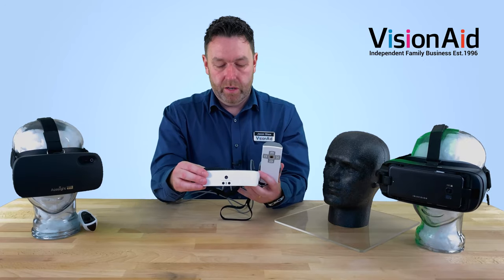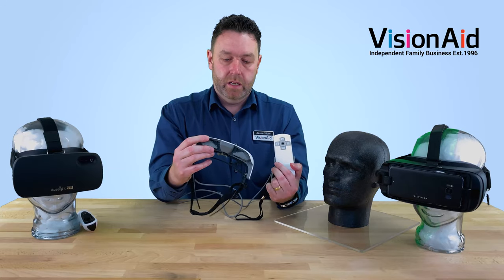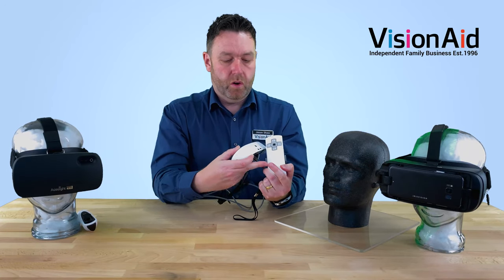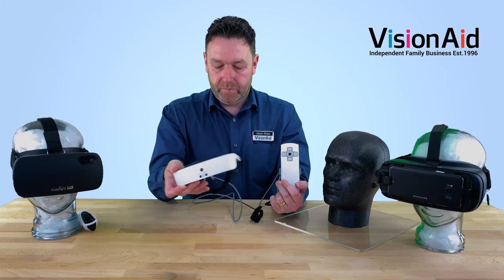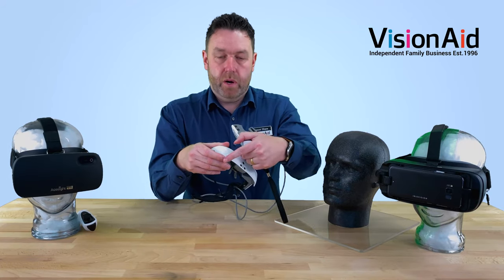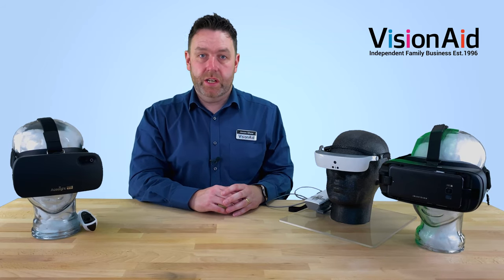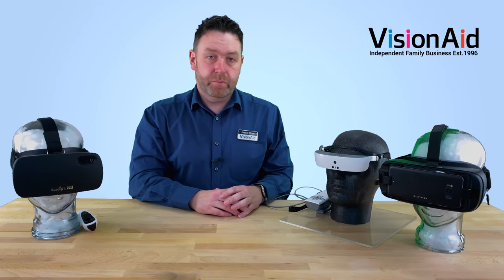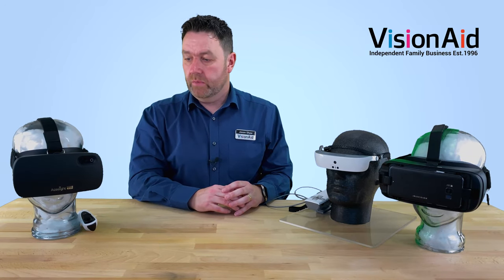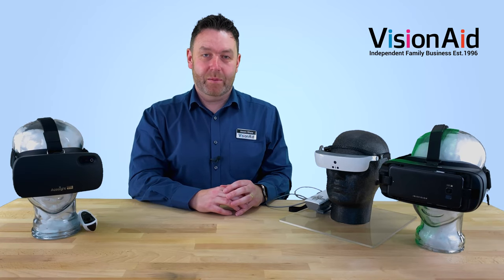The eSight is the most expensive one, but it's almost custom made. You can get it in white or black finish, so if you're fashion conscious you can choose whichever you prefer. Nice unit with a slim profile — and that's the eSight. So that's just a small selection of VisionAid wearables. If you need any more information, please get in touch, or if you want to arrange a demonstration, just let us know and we'd be happy to help. Thanks for joining us. Bye-bye.